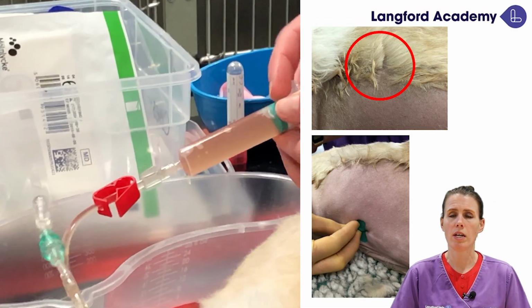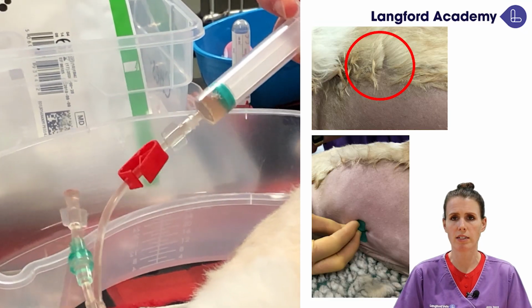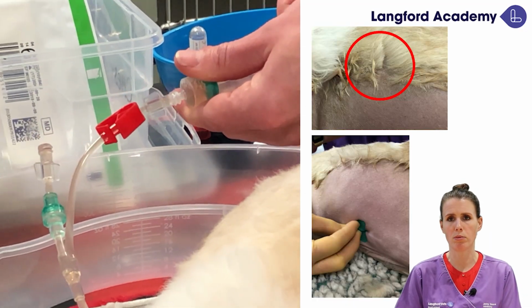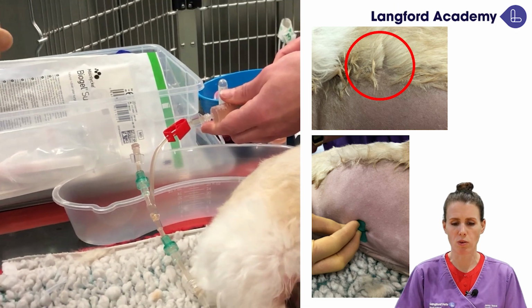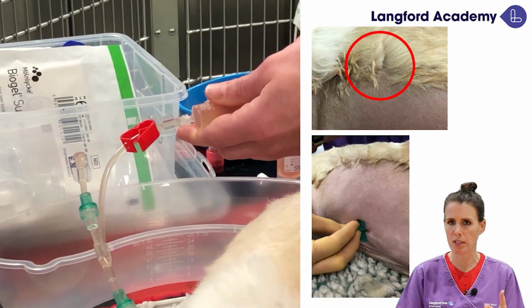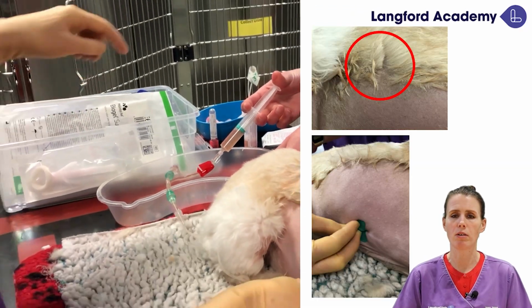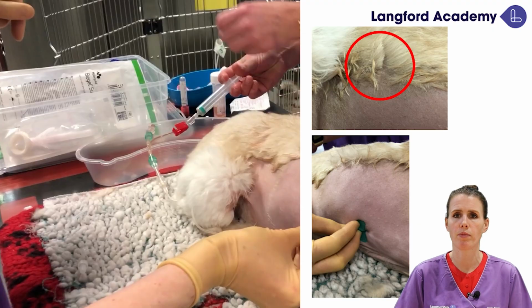The other thing is it's really important when you're aspirating on the chest contents with the syringe to not generate excessive negative pressure. So you want only a really small amount of negative pressure and a few air bubbles in the syringe. If you apply really excessive negative pressure, you're going to risk sucking any fronded material that's in the chest cavity into the hub of your needle or the point of your needle and causing an obstruction. So do be careful not to use excessive negative pressure.